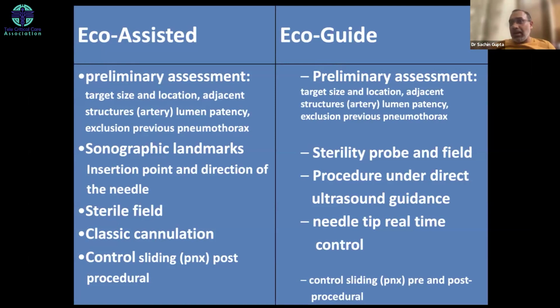This is what we practice and preach, that all procedures have to be echo guided and not echo assisted, because echo assisted varies on multiple things. What is the position of the patient? Once you have assessed the patient and the patient changes position a little, your assistance is gone now, because the direction or position that you thought of has changed. So echo assisted is equal to a blind procedure.